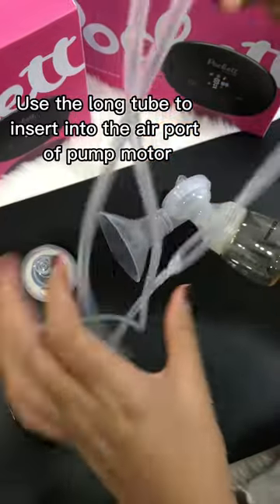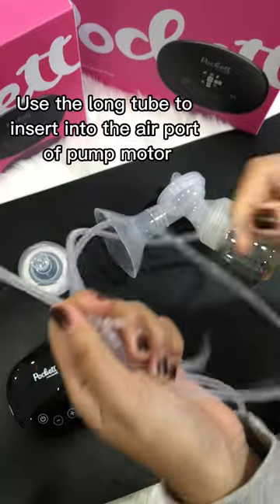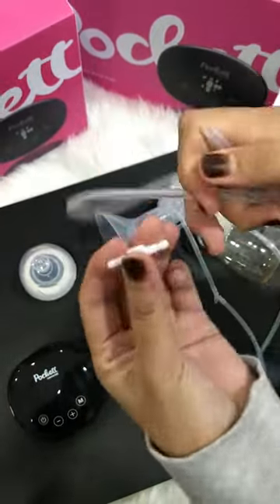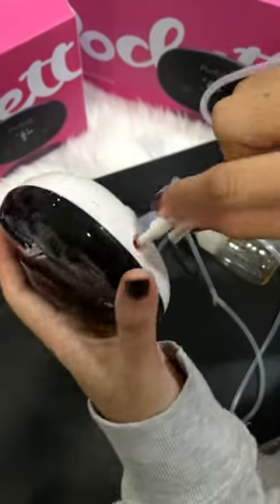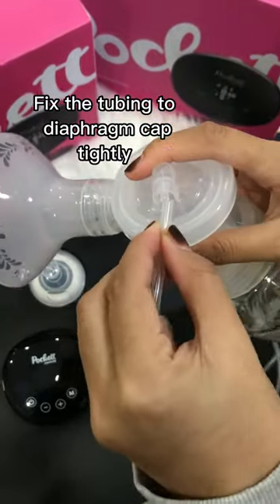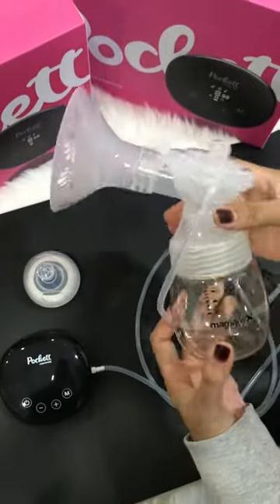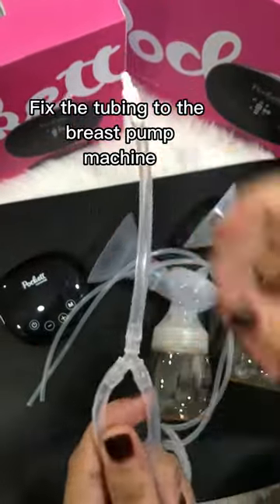Use the long tube to insert into the air port of the pump motor. Fix the tubing to the diaphragm cap tightly, then fix the tubing to the breast pump machine.